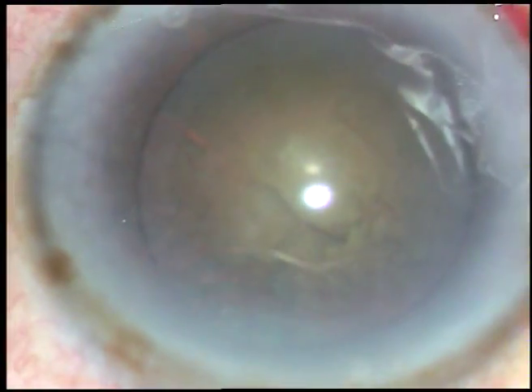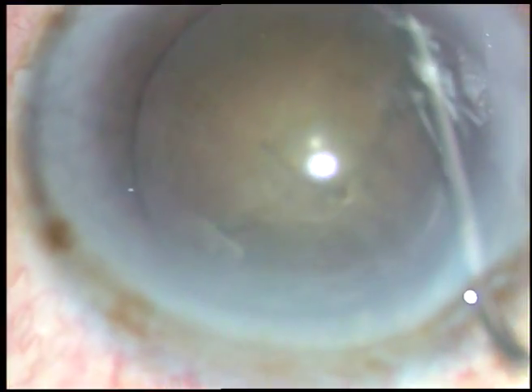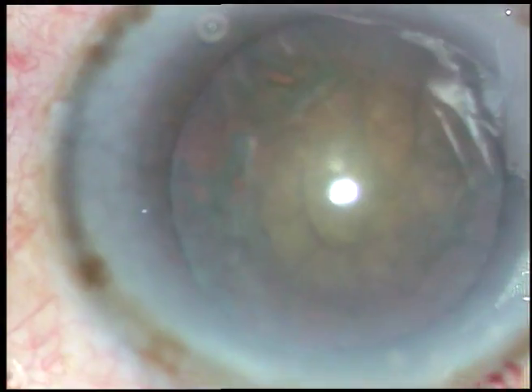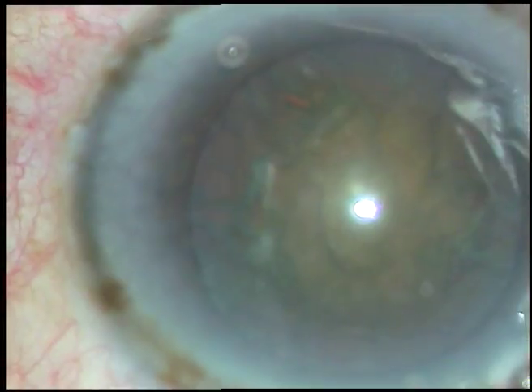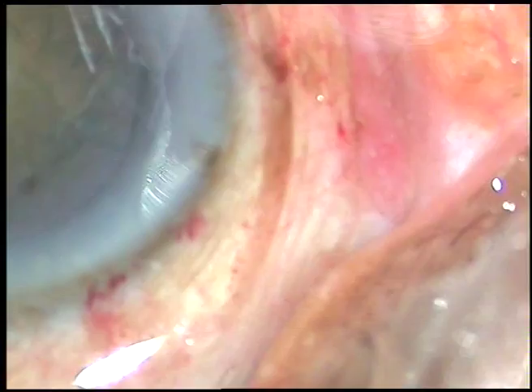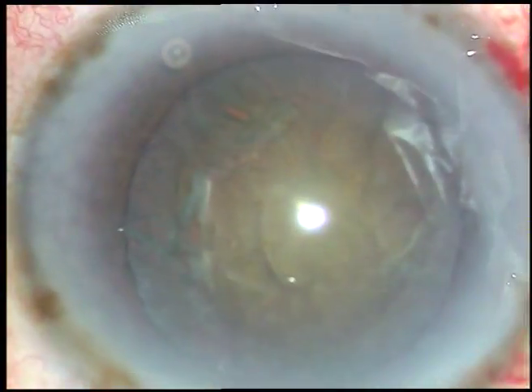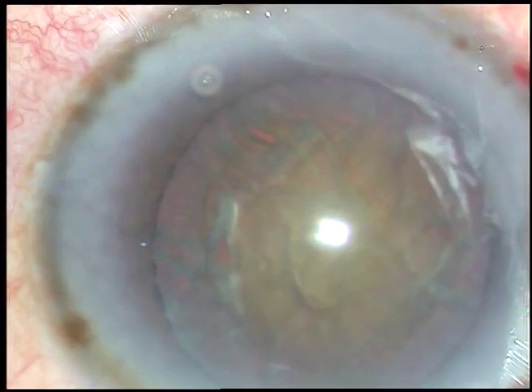Now hydrodissection is done. Hydrodissection should be done very nicely — we should see that the fluid wave is going to the opposite side, and then as we ballot the nucleus, the fluid wave should come anteriorly along the border of the equator. Now is the time to introduce the tip of the phaco handpiece.